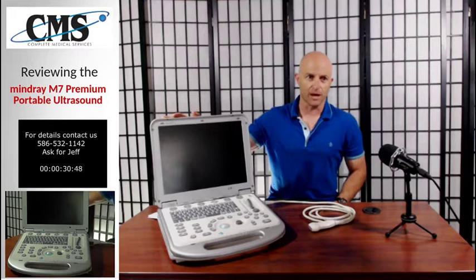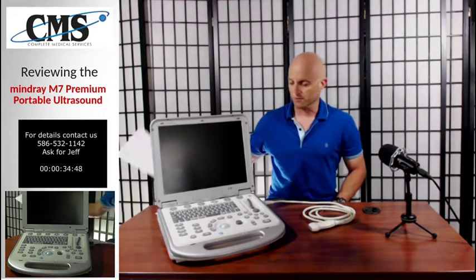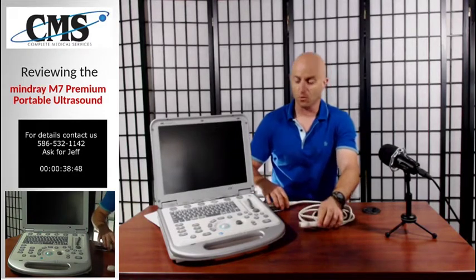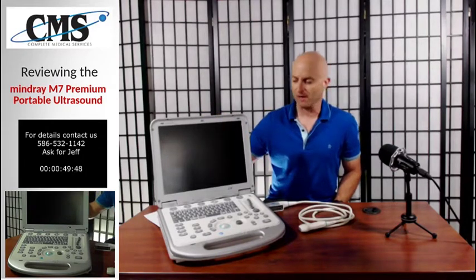Today, we're going to be discussing the Mindray M7, which I have here in front of us right now. This is one of the transducers, which we'll be using in one second to fire up this system. I just want to show you how easy it is to get the system set up. But first, we're going to look at the specs of the Mindray M7.